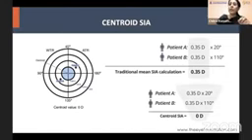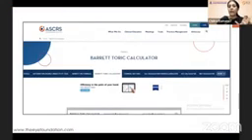Because if you only looked at the magnitude of the astigmatism, it would tell you that the SIA is different. But if you look at the axis, you will find that the axes actually cancel each other out. Overall, we understand that for any incision less than 2.8, for 2.4, the centroid value was only 0.1, and that all needs to be factored in.